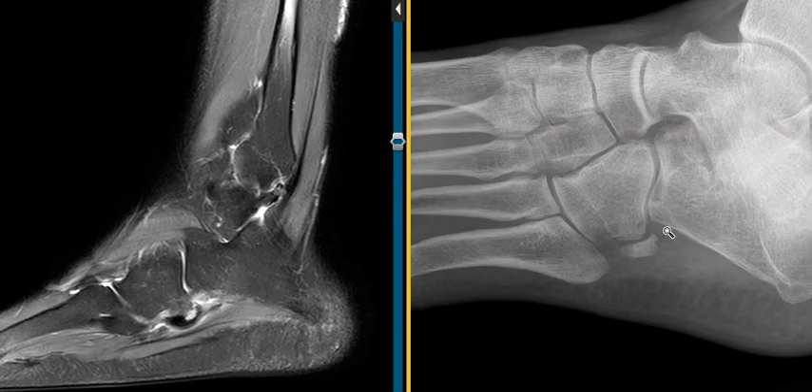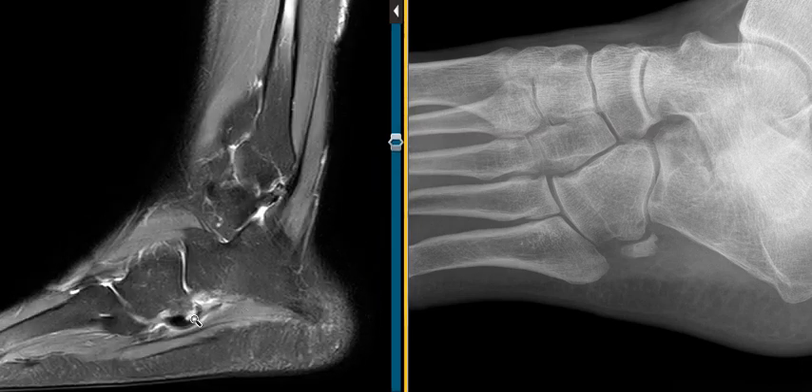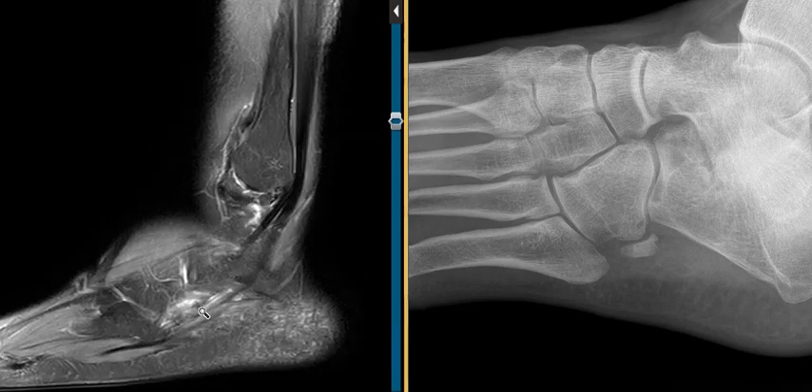Thank goodness we have the X-ray, otherwise we'd be hedging a bit more. In this case we can say that there is stress injury or some other abnormality of the os peroneum, and this would go along with painful os peroneum syndrome. Thank you very much.